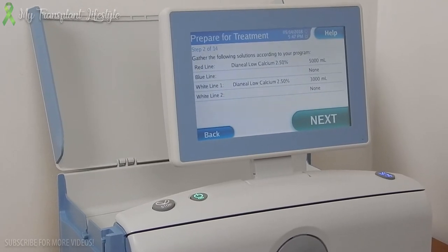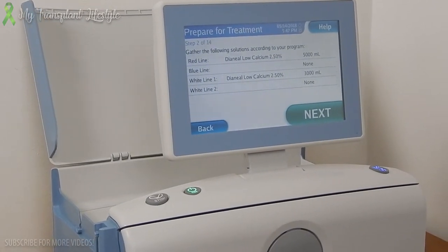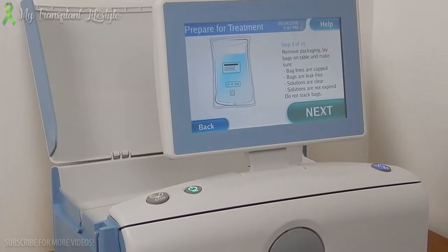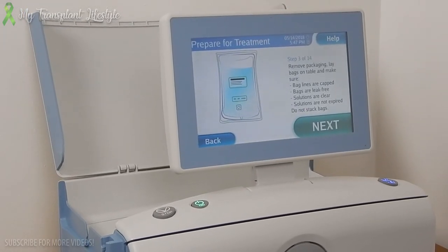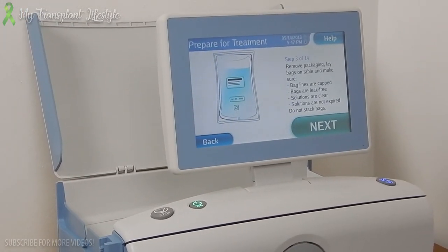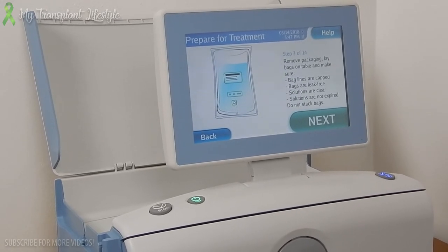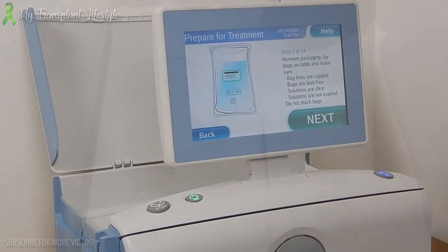Now the machine will let you know which solutions to get based off your treatment. Remove bags from packaging. Lay bags on table and make sure bag lines are capped, bags are leak-free, solutions are clear and not expired. Do not stack bags.